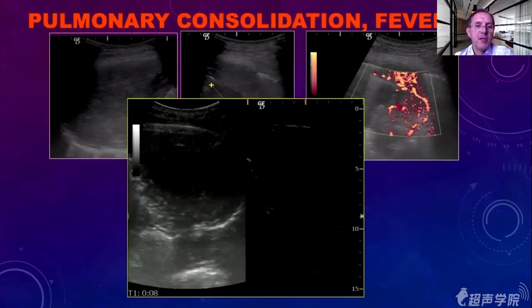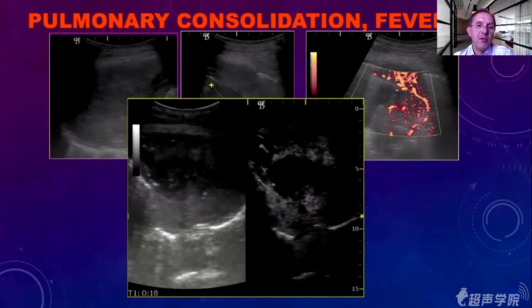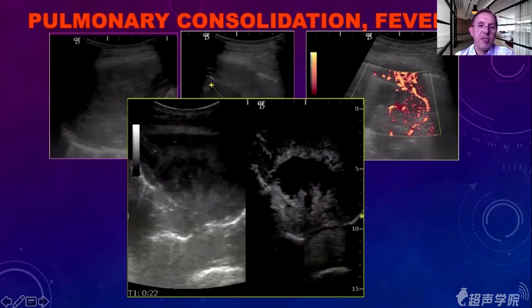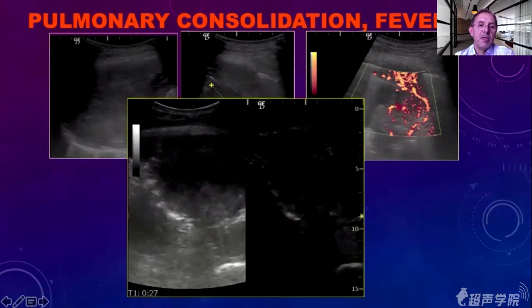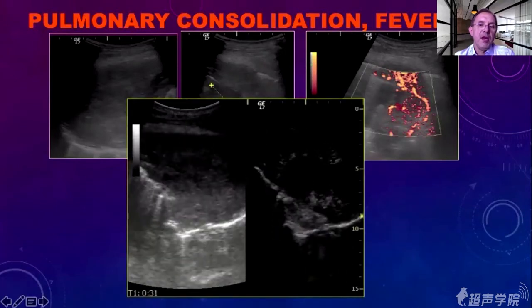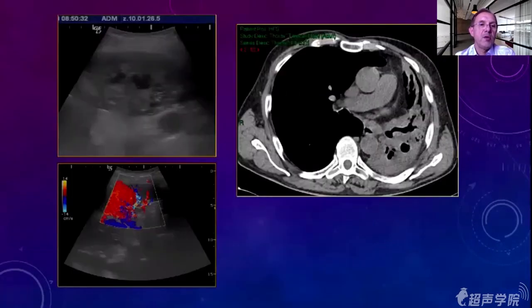It was a smoker, and you see that the mass is starting to take up contrast at 30-40 seconds, so bronchial artery supply, but the center of the lesion here was unenhanced. With no enhancement, we expect necrosis and an abscess. So it was an infected tumor. We did a biopsy from the peripheral part, and a tumor was diagnosed.